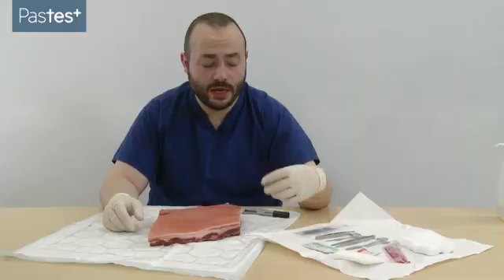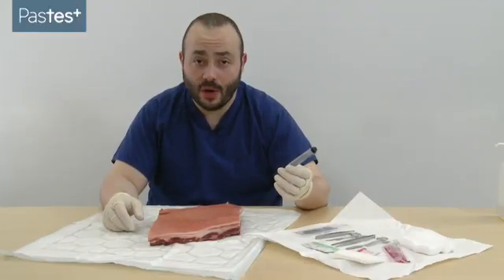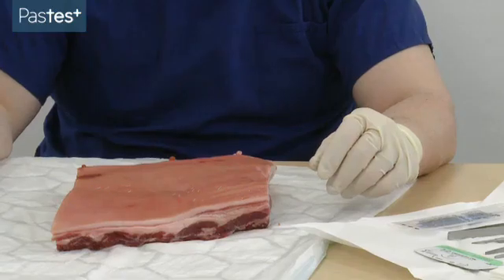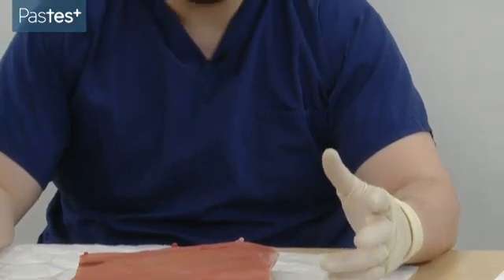The other thing you may or may not need is a pen to mark out your incision — if there's one available I would always use one. Having checked that it's the appropriate patient, make sure they're appropriately anesthetized, either under a general anesthetic or local anesthetic. Local anesthetic infiltration is covered in another video. If it's local anesthetic, use your tooth forceps to check that the block is working.